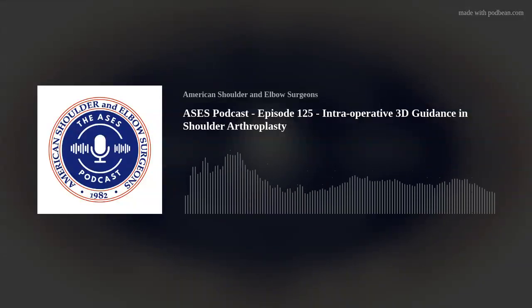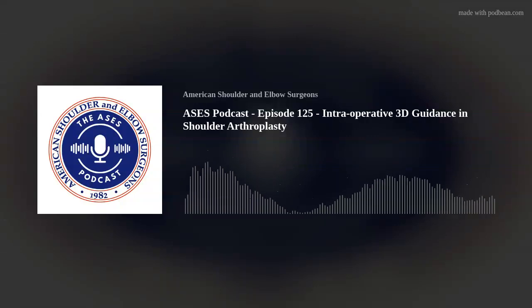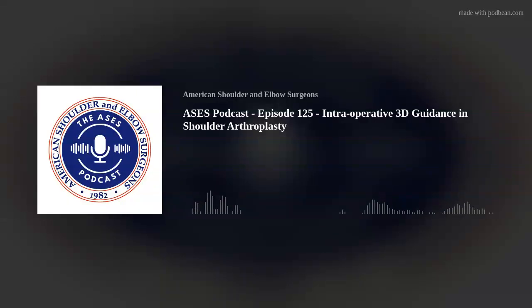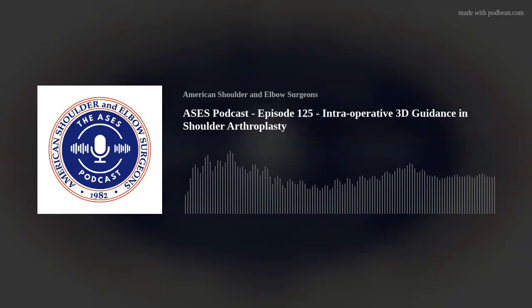Our data would show that navigation is within a degree or two of our plan, based on Ryan Simovich looking at some of his post-operative CTs. But that would be my case for navigation. I do think it's actually time neutral. By the time you get some experience, I use it on every case because, again, I am not as good as I think I am.